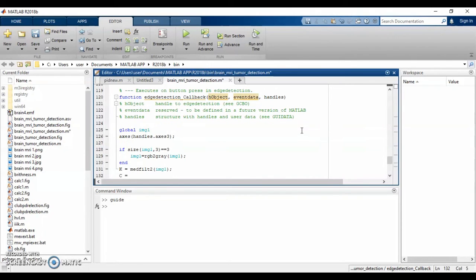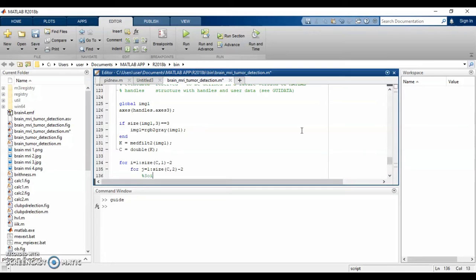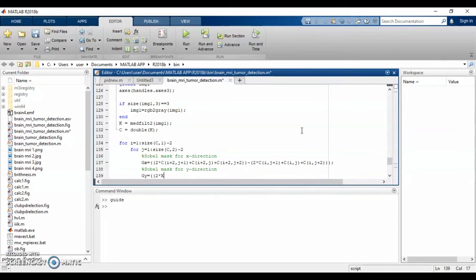So for edge detection in our project, we will use the Sobel gradient operator. And so here is the script for the Sobel gradient operator for edge detection. The Sobel gradient operator is actually used to find out the amount of the difference by placing the gradient matrix over each pixel of our image. So we will need to find the Sobel mask for the X direction, and then followed by the Sobel mask for the Y direction.